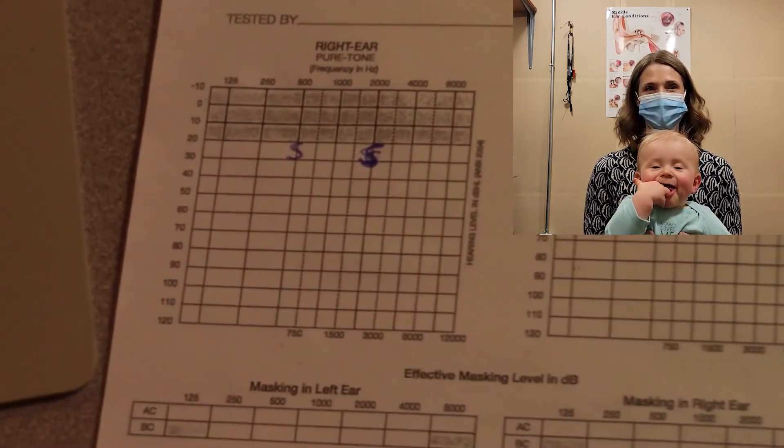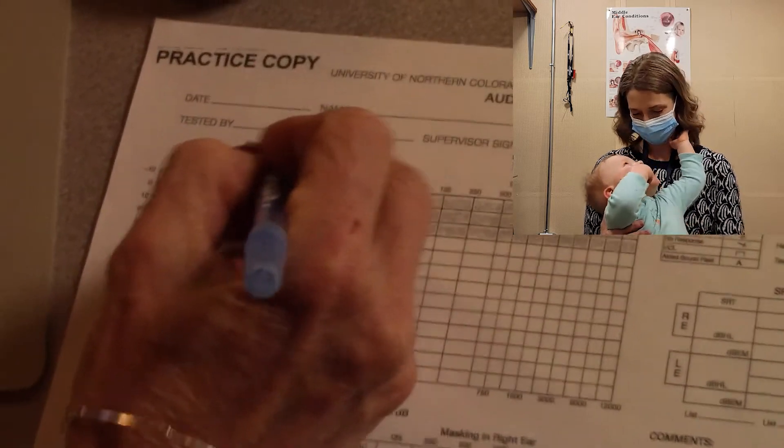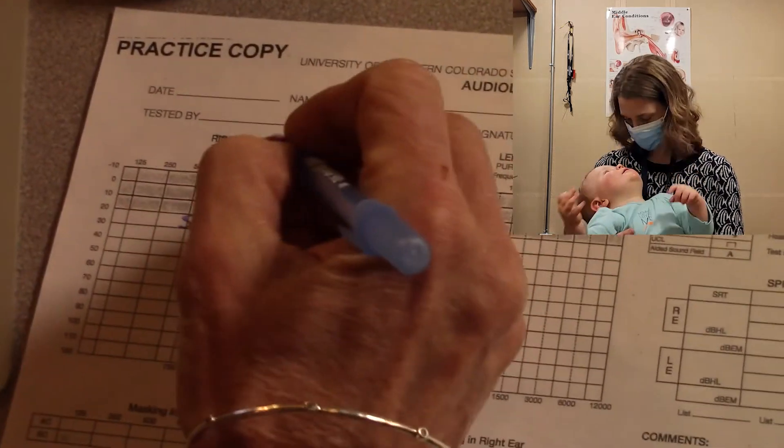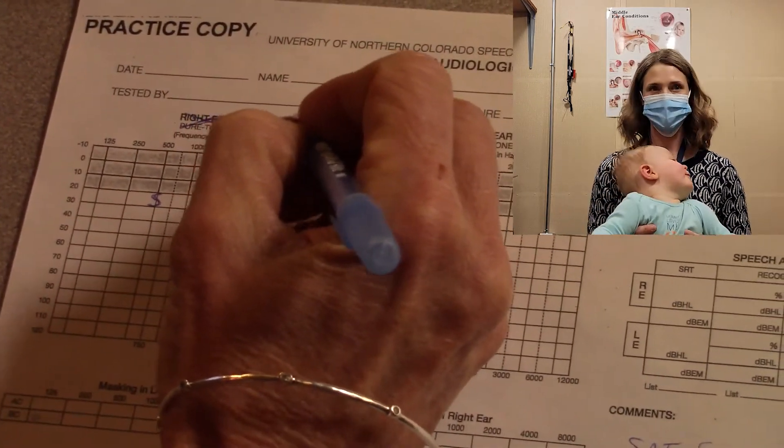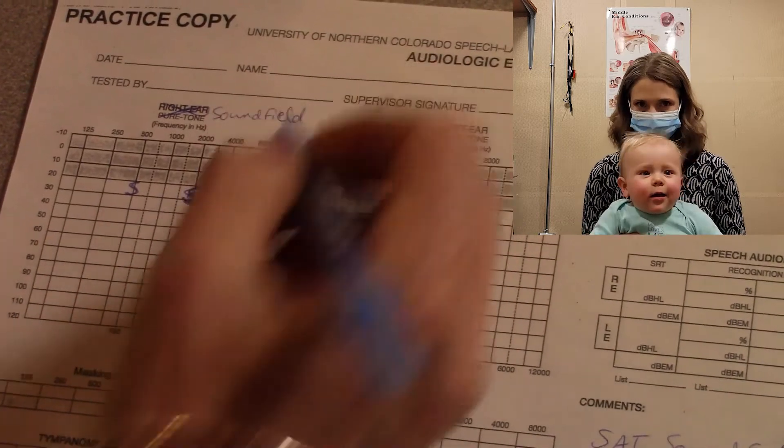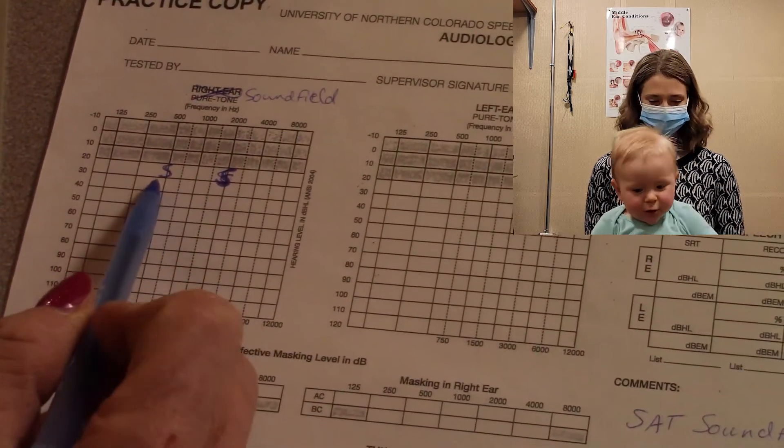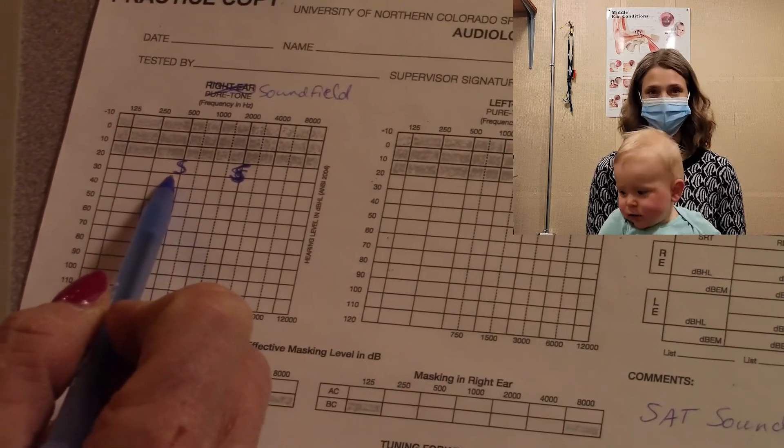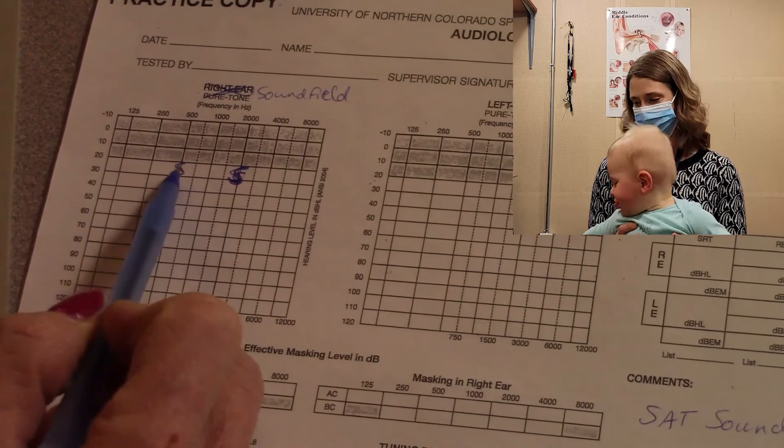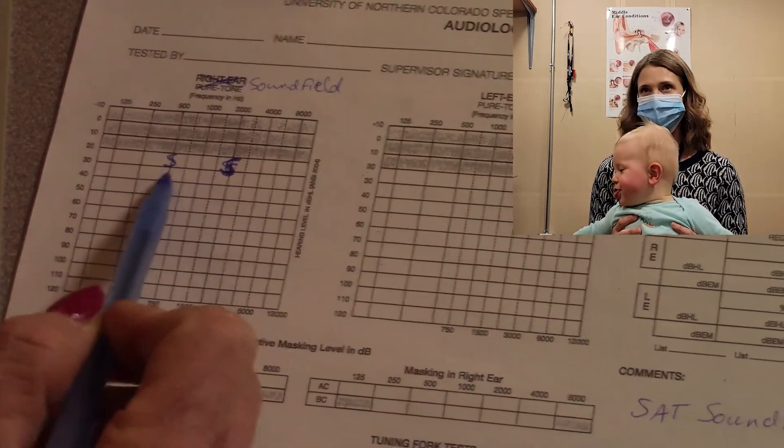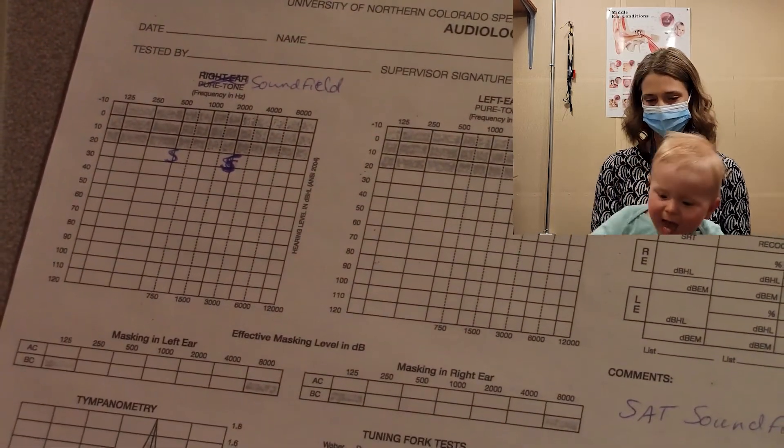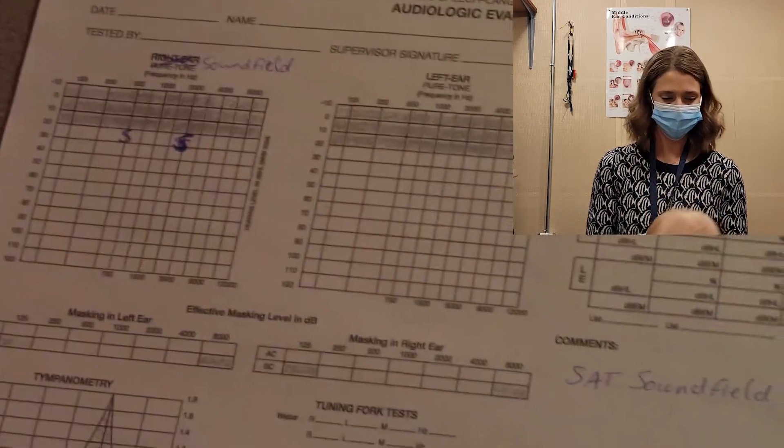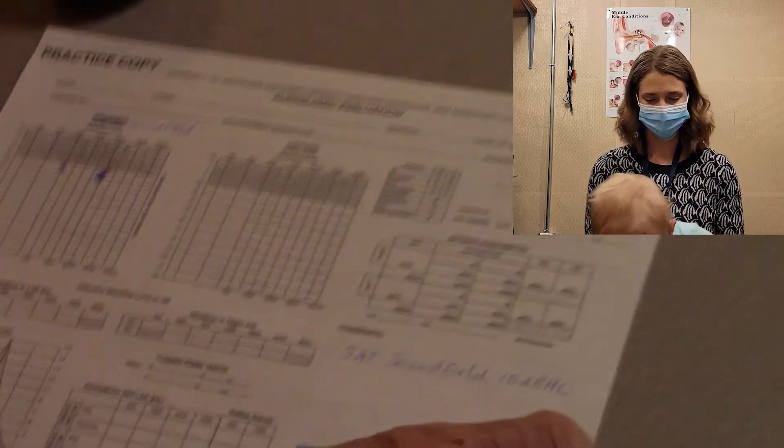Okay. So I think that's probably good. This, of course, is not the right ear. It's sound field. And then I'll make a note. Localizations to warble tones and peds noise. Utilizing VRA. Okay. We'll go let mom out. There you go. Connor, you did so good. Dancing, baby.